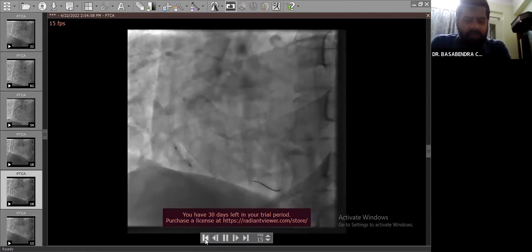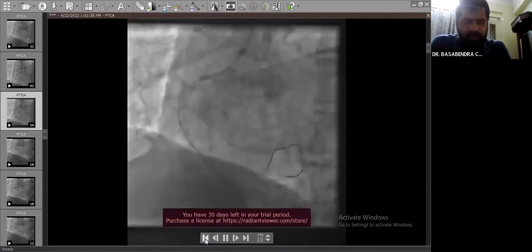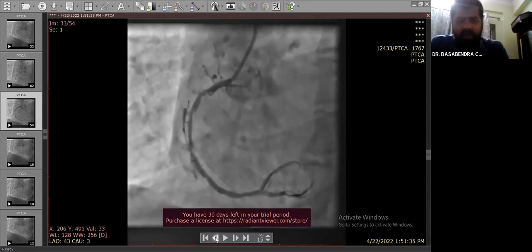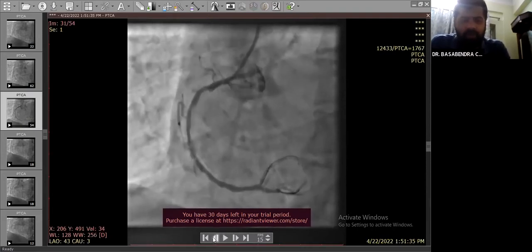However, the angiographic shot showed that even after dilation with the 1.5 balloon, we had created a channel passage, but the dilatation was not adequate. And also calcium could be seen at the proximal and mid parts. And we were not sure if we could actually take the stent down to the distal RCA.